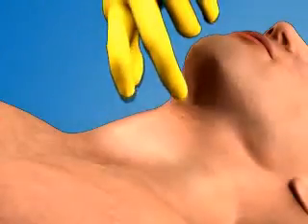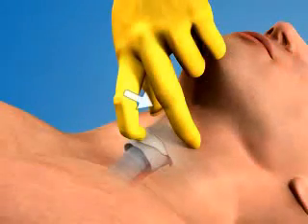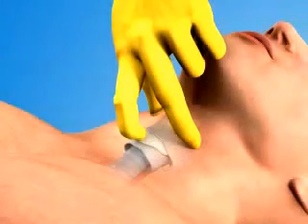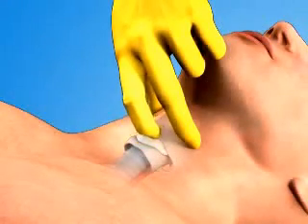Stabilize the larynx with your non-dominant hand by grasping the sides of the thyroid cartilage with your thumb and middle finger. Use your index finger to palpate the depression over the cricothyroid membrane.